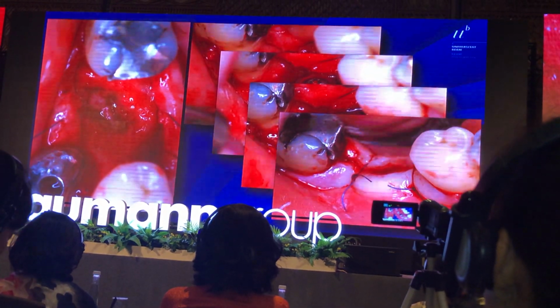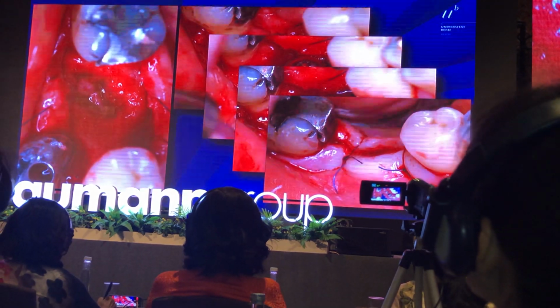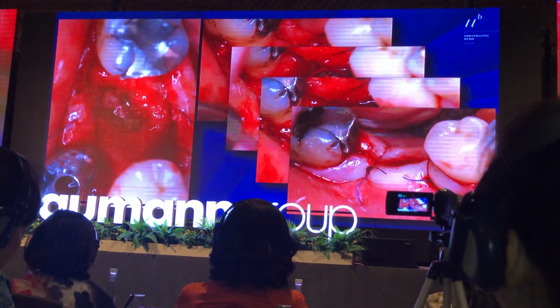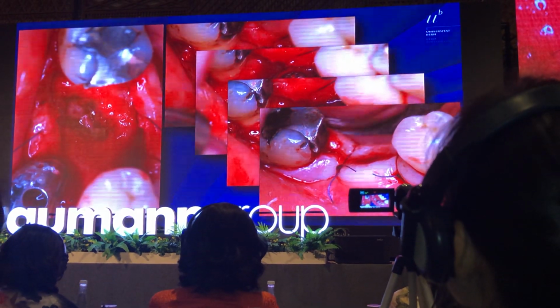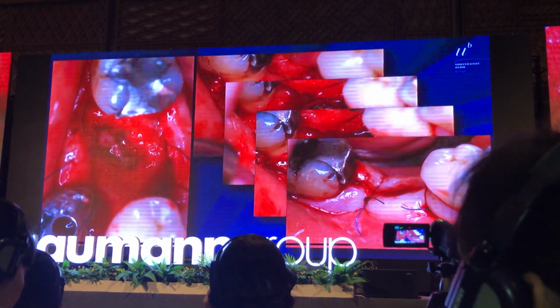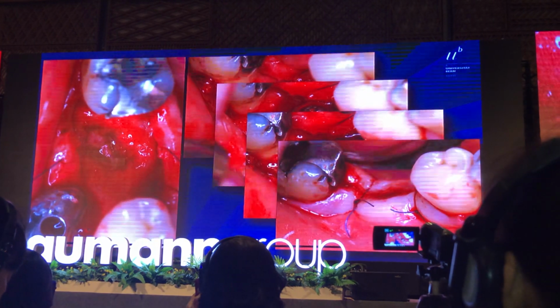You see the old fillings of that lady, the old amalgam filling. I told the dentist that before making the implant crown, please exchange the filling, so get this amalgam out. In Switzerland, amalgam is completely out. I don't know if you still use amalgam here in Vietnam. In the dental school in Bern, it was abandoned in '92, a long time ago.